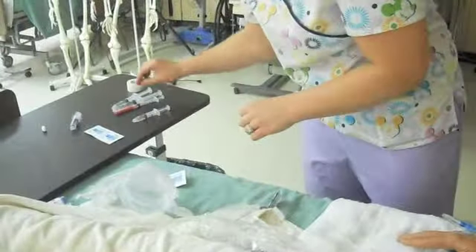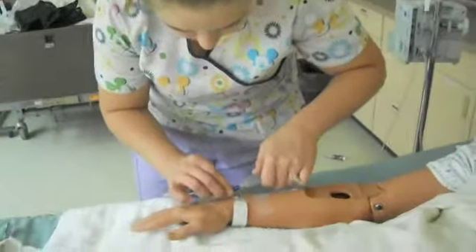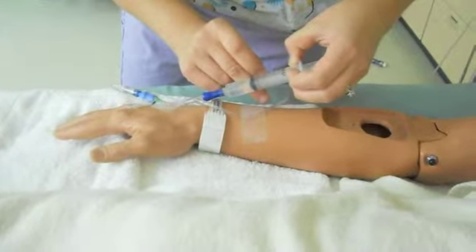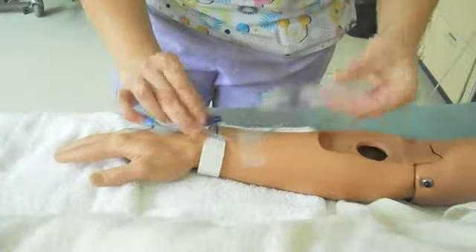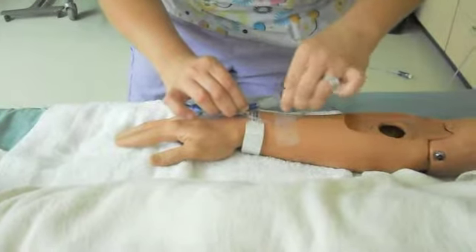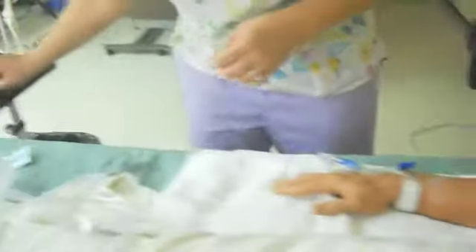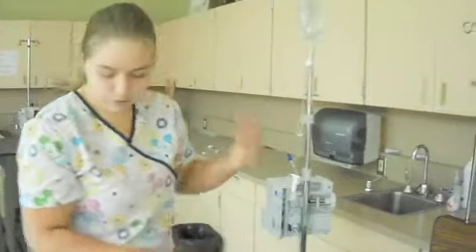Now I'm going to be giving the medication that we know is not compatible. I'll give that medication and make sure I check the time — if it needs to go in within a minute, you'll wait that time. Once the medication's in, take another IV flush. This is all sterile to sterile right now, so I'm not breaking any sterile fields. Then we'll flush again with the normal saline, and then we've given that medication. We'll open back up the slide clamp and it's still dripping appropriately.